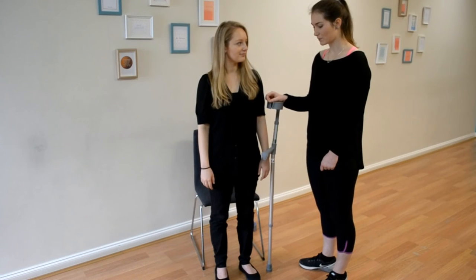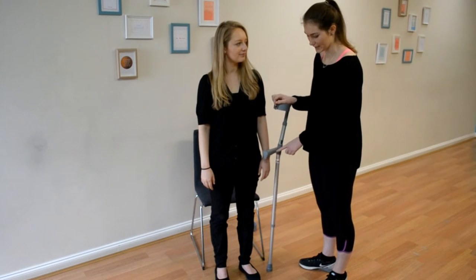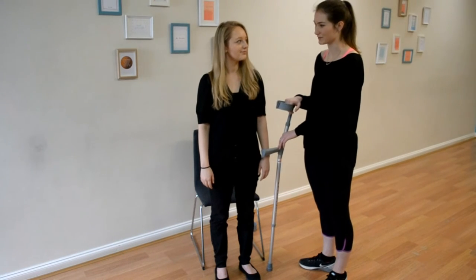The first thing I'm going to look at is where the arm of the crutch is in relation with Alex's wrist crease. As you can see here, it's a little bit above, which means the crutch needs to be dropped down so that it's the most comfortable height for Alex.